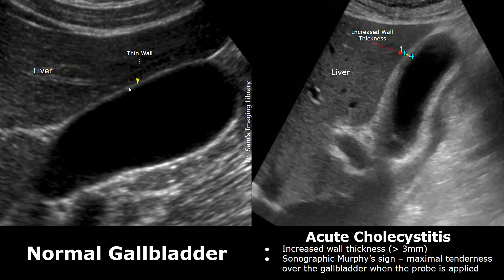The image on the right is of acute cholecystitis. When the gallbladder is inflamed, its wall thickness will be greater than 3 mm. Here we can see a thickened gallbladder wall. You can see this wall appears thicker than the wall in the normal image.